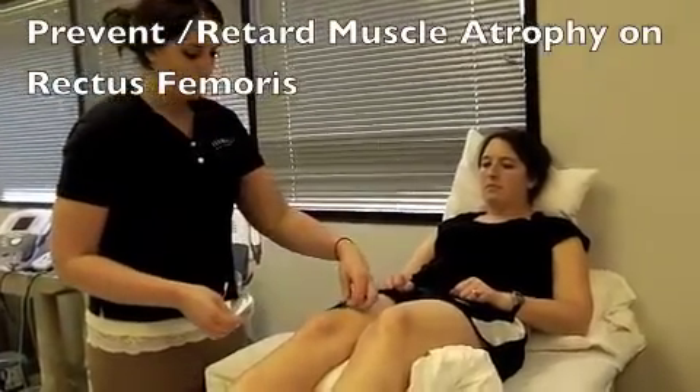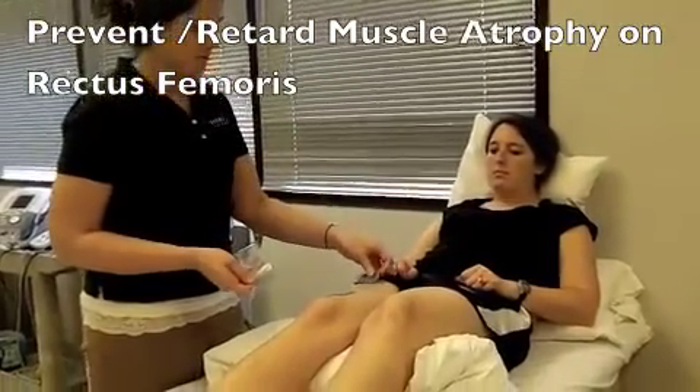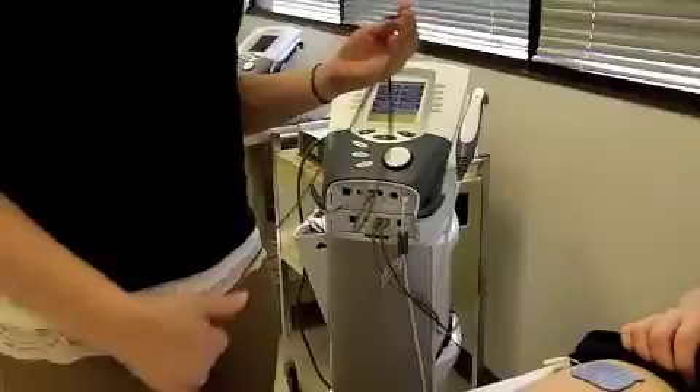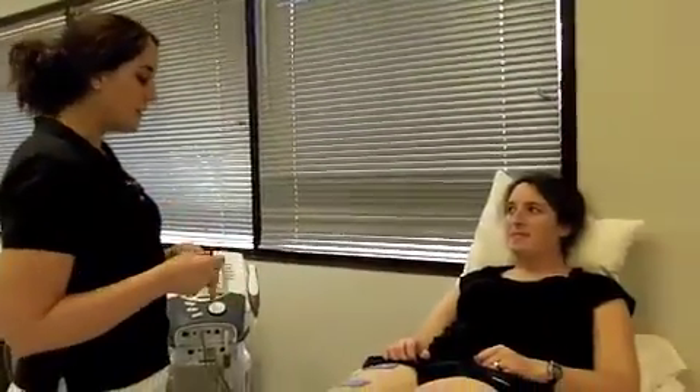We're going to have one right here and another one up here. We're going to use the Russian technique, which is going to help with some muscular re-education.